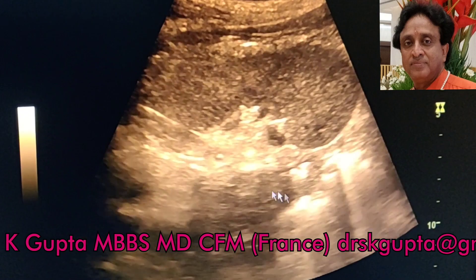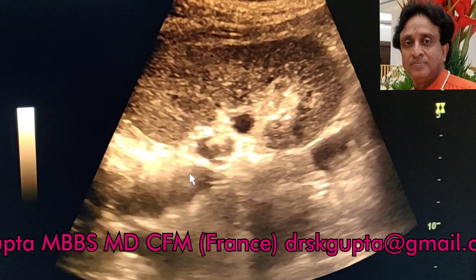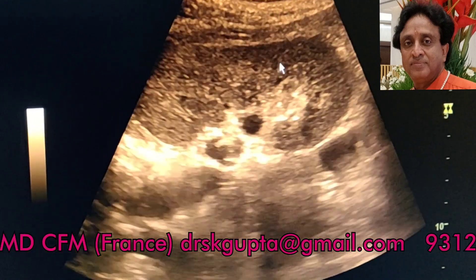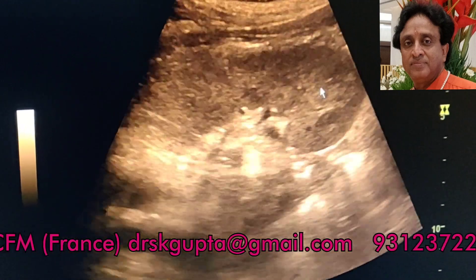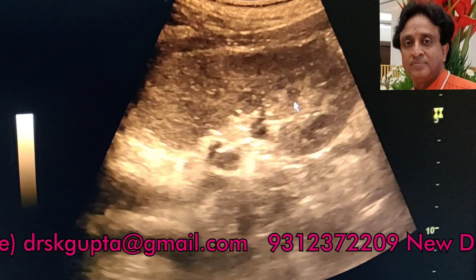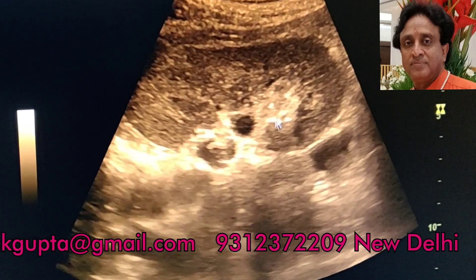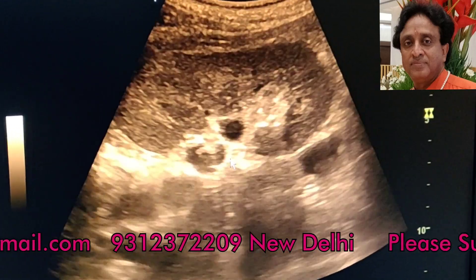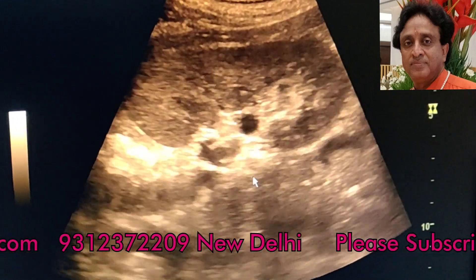You can see that this is the right kidney in the patient and this kidney appears to be absolutely normal with normal corticomedullary differentiation, normal pelvis of the kidney, and normal vascular supply.